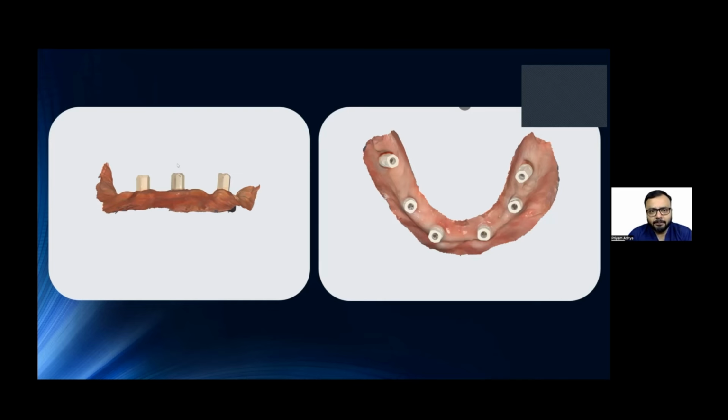So when you are scanning, please understand that the scanner also needs your help. If you keep moving the tissues, the scanner will not be able to correlate them, and hence you will have problems. Similarly, bleeding gums and bleeding emergence profiles are also a problem because the scanner cannot capture blood. A small drop of blood or fluid on gingiva or margins might get recorded by the scanner, and that will lead to a distortion in the margin, which is not there. That will lead to open crowns.